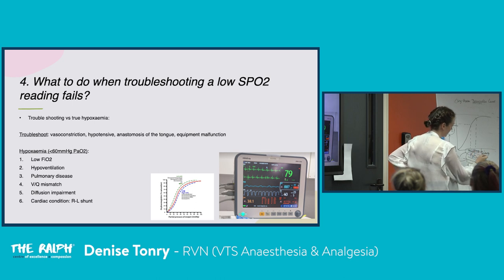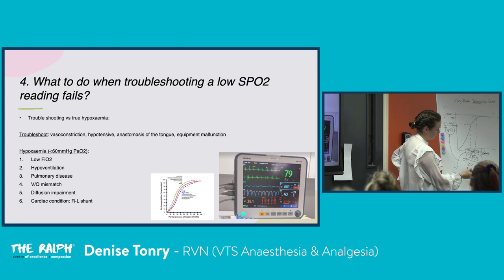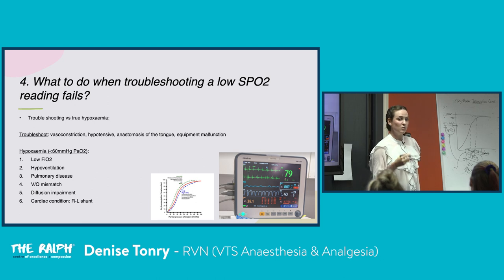The rest are, let's say, severe. We have a mild hypoxemia and we have none at all up here in our little window. And you can see that as we add 100% oxygen, it will never really drop our SpO2. If it's dropping, that's the true concern. Why is it dropping? Because we're providing these guys with 100% oxygen. For argument's sake, we're providing 100% oxygen, but we never truly are, because the inhalant, if you're using it, will take up a percentage of that. Usually we're achieving 97, 98.